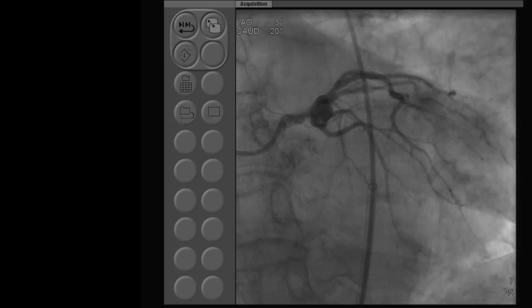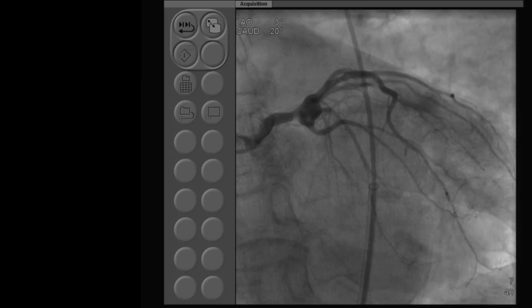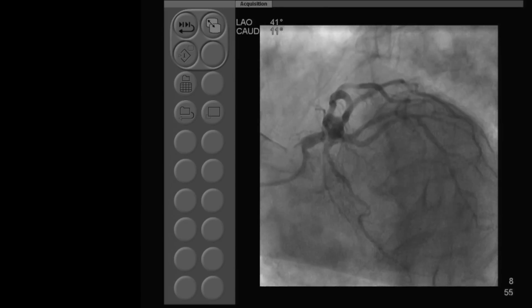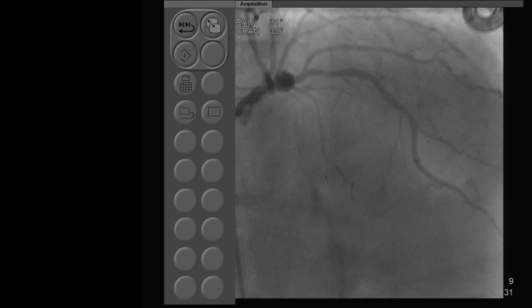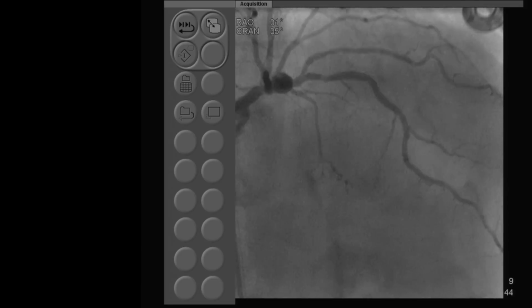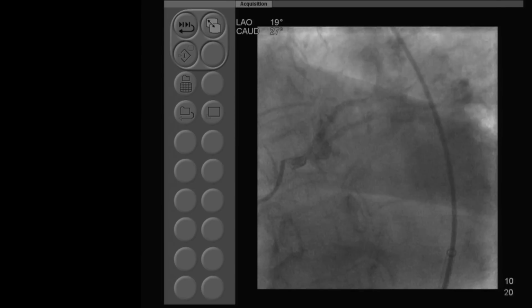But this is where we are with the left main. Definitely calcific distal left main, and we took several pictures to exactly see the ostium of the circ. But what you see is that aneurysm probably coming from the left main itself. Here it was not clear, but in the cranial view, it's probably coming from the left main, and then you have the mid LAD, another 80-90% disease. But in every view, I think the circ is okay.